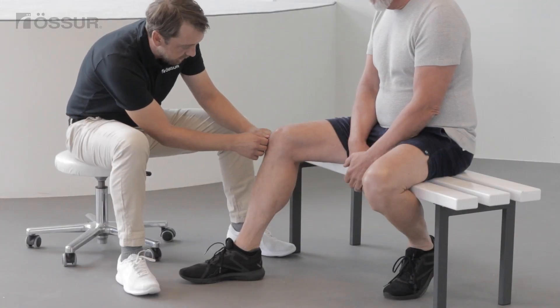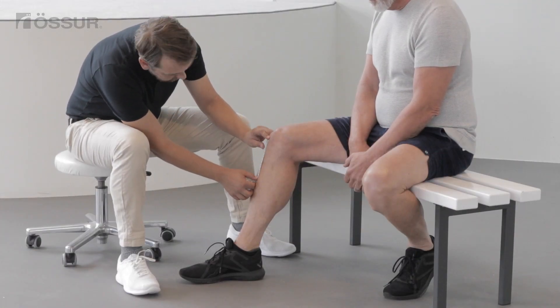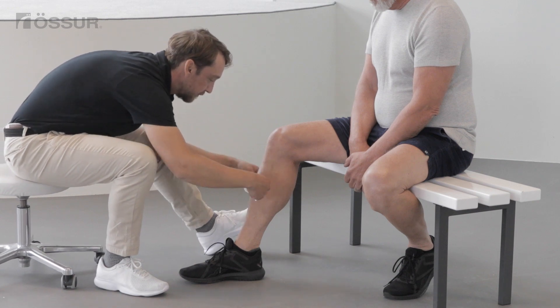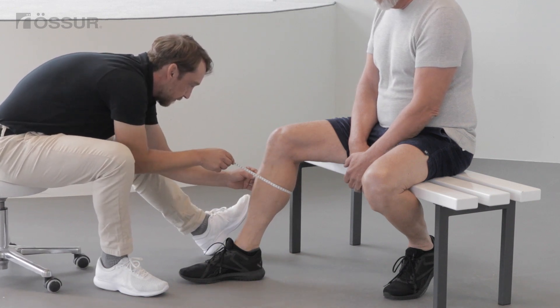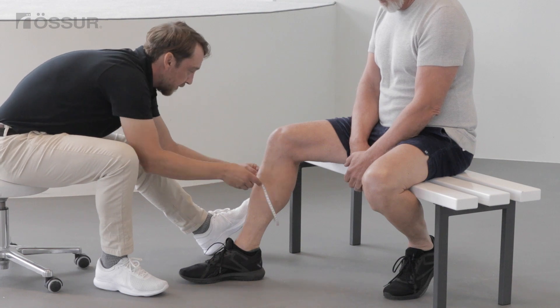To determine the right brace size, measure 6 inches or 15 centimeters below mid patella and take a circumference around the calf. The configuration required is selected according to which side of the knee is affected.